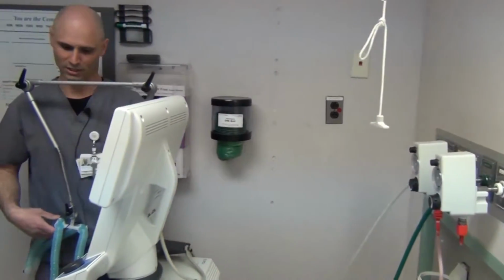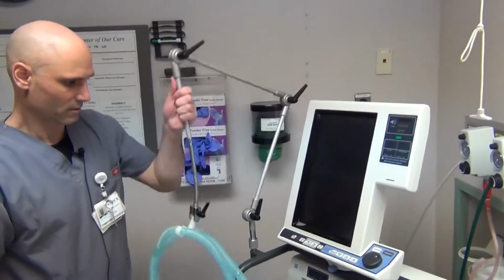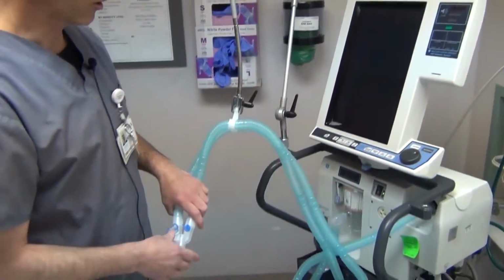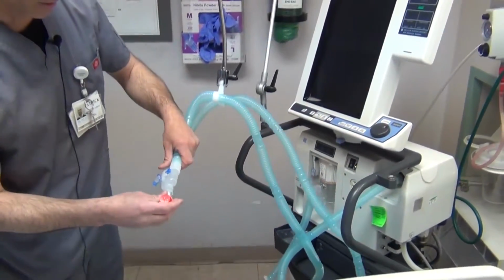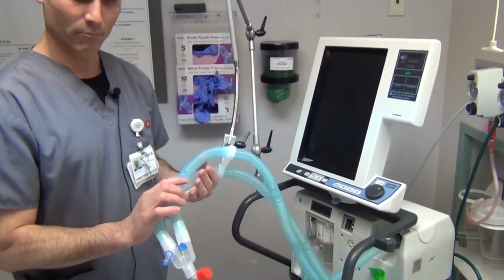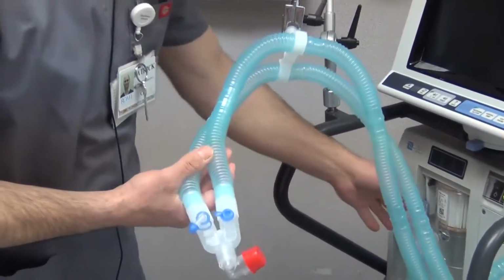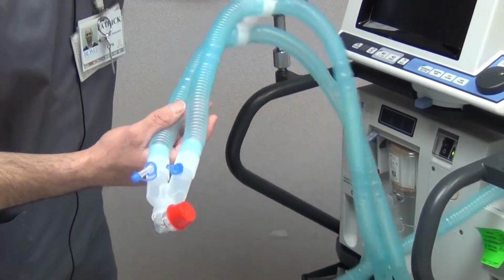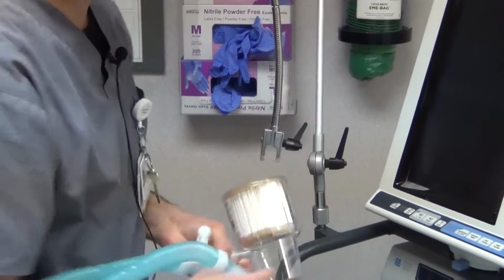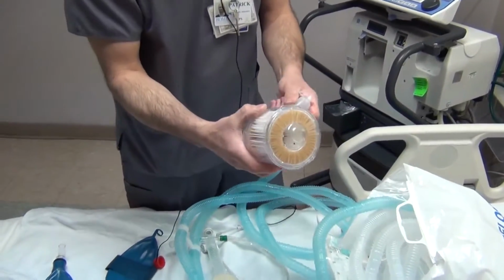We'll go back to the front of the machine. Anyway, when you get the machine from our room, it'll have the ventilator circuit already attached. But for purpose of education, I'm going to take it off and I'm going to show you how to put it together. This will just take a brief second. This will be important when it is time to troubleshoot and if something's wrong with the circuit.